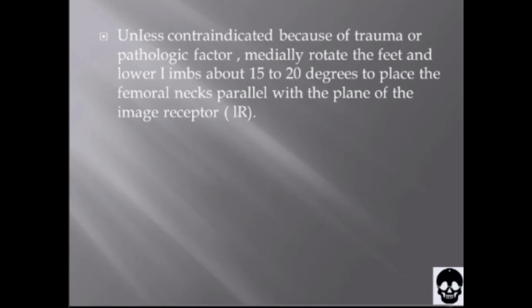Immobilize the legs with sandbags across the ankles if needed. Check the distance from the ASIS to the tabletop on each side to be sure that the pelvis is not rotated.